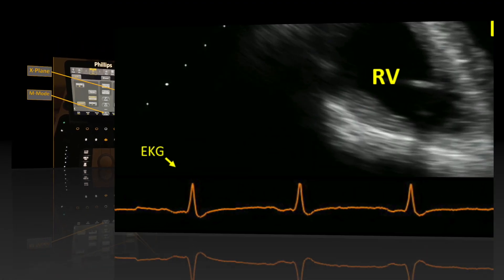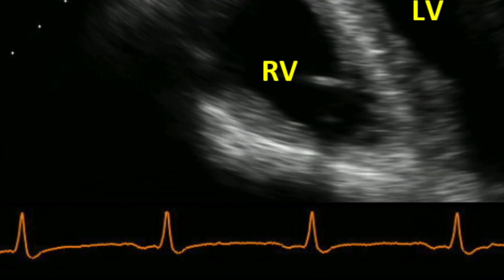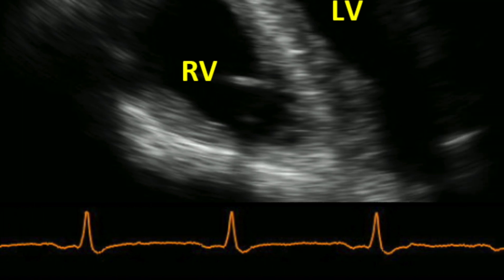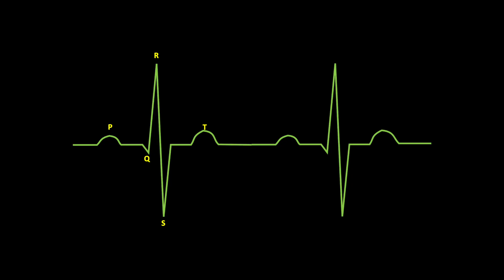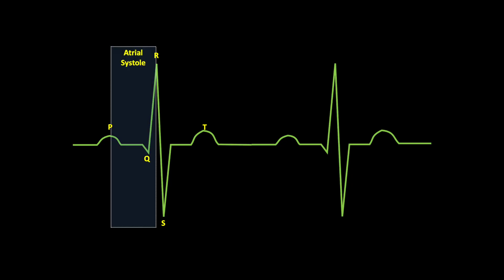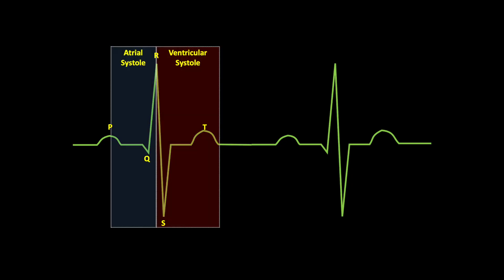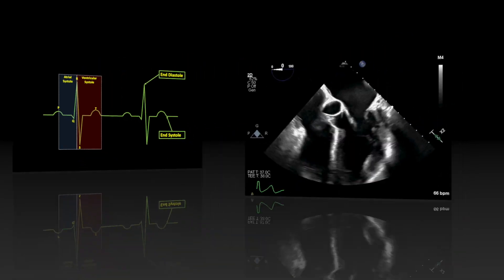Along the way, it is critical to have capture of the EKG and understand that some measurements are made at particular points of the cardiac cycle.